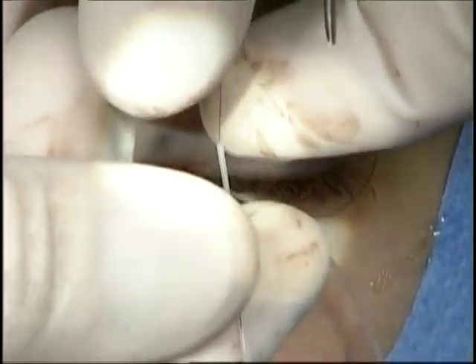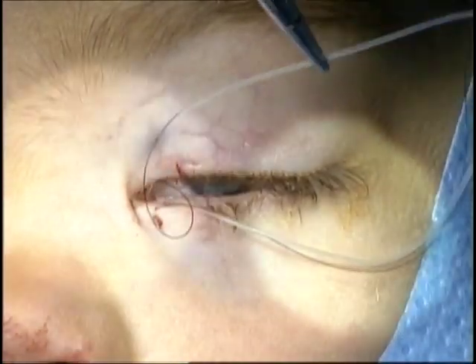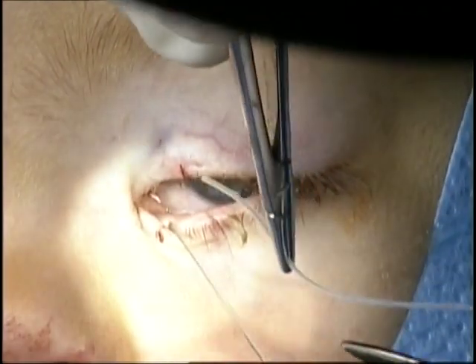The nylon suture goes through the upper punctum. The stent is then fixed to the nylon suture and rotated through, then retrieved from the lower punctum.